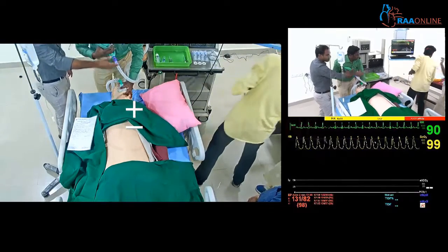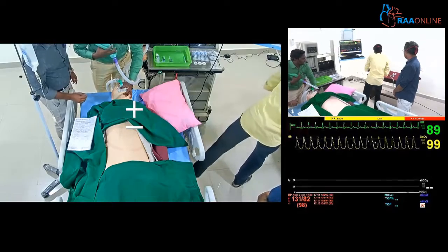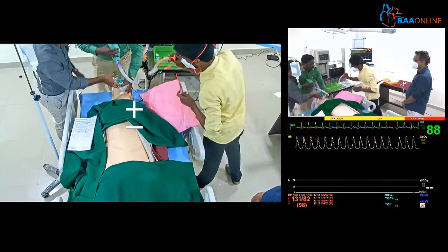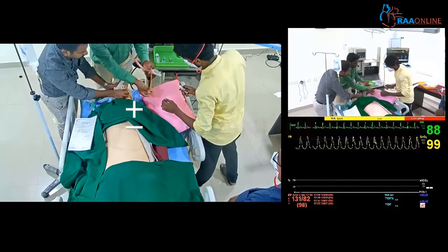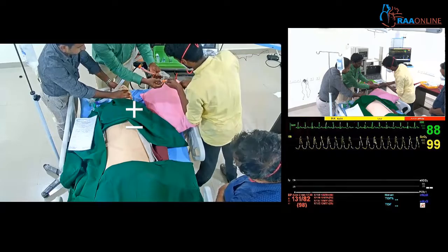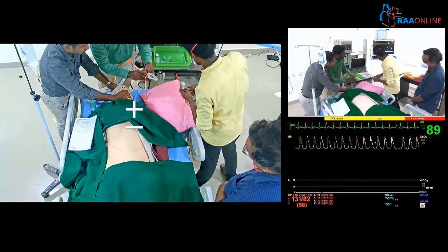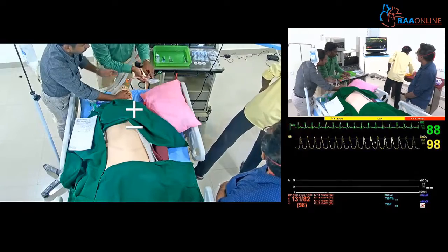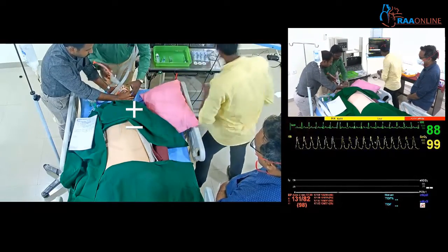Supraglottic airway device. LMA size 4, 5. Size 4 or 5, is it there? Okay. Put the LMA. Size 4, put it. Whatever it may be, you put LMA. So, deflate that. Okay. Get a gel. No issues, no issues. Okay. Right.